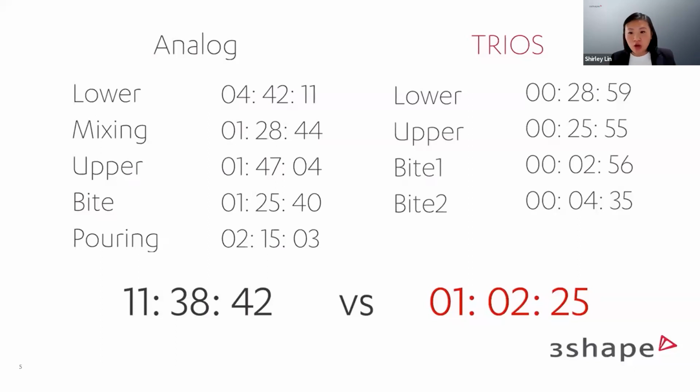Now, I know some of you probably use triple tray impressions that are also very quick, but the lab will always say they prefer a full arch impression to assess. Triple tray impressions are fast and easy in the chair, but in the lab can affect the fabrication accuracy and result in you spending that saved time on adjusting the crown during your insertions. So when using an intraoral scanner, it will only take you a couple more seconds to get a full arch scan to give the lab more references to create more accurate lab work for you.